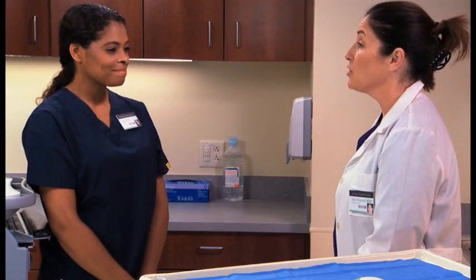Okay. Now, do you have all the equipment you need? Yes, I have the irrigation set in the room. I also brought a waterproof pad to help keep the patient and bedding dry, and gloves to put on when I administer the medication. Now I'm going to perform hand hygiene. Okay.